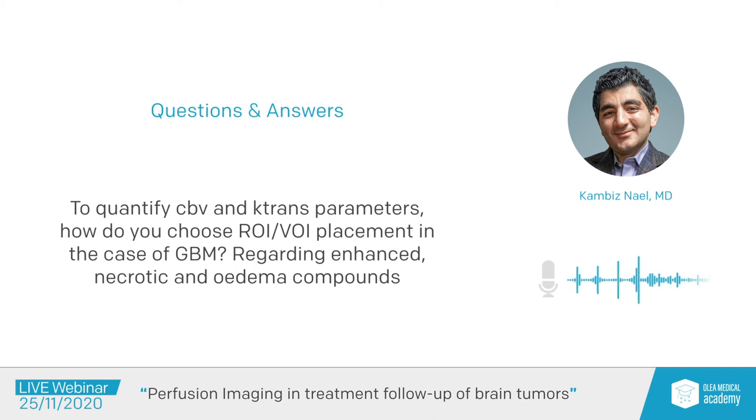So we analyze the data only within the enhancing tissue. We basically generate a volume of interest over the enhancing component. We use T1 post-contrast images, and a volume of interest is drawn over the enhancing component. That is done by our fellows or the faculty. And the same for K-trans. So everything that I told you, we don't really draw ROI over the FLAIR hyperintense non-enhancing component. Everything I show you is based on enhancing tumor or enhancing tissue.